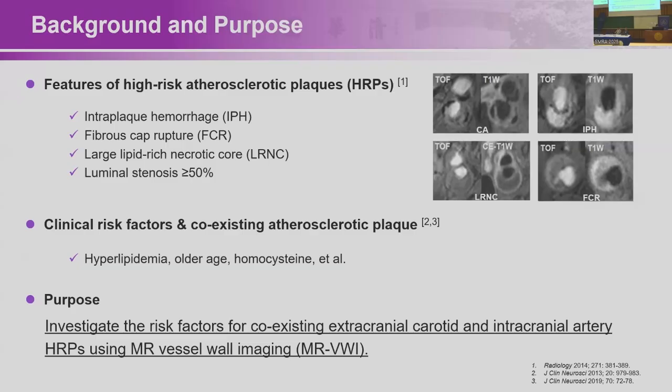In the present study, we sought to investigate the risk factors for coexisting extracranial carotid and intracranial artery HRPs using the MR vessel wall imaging.